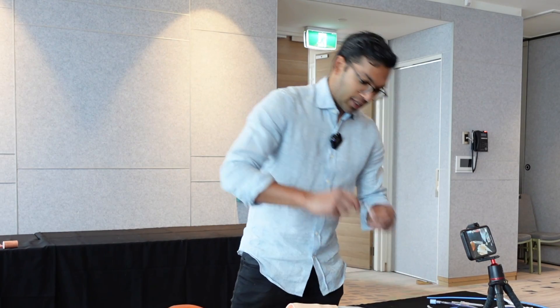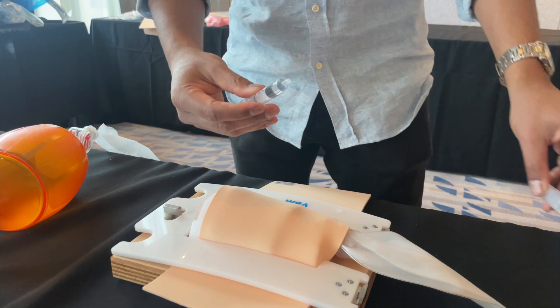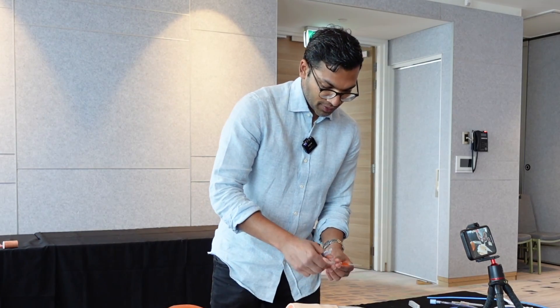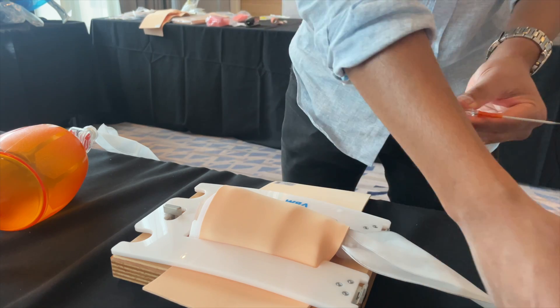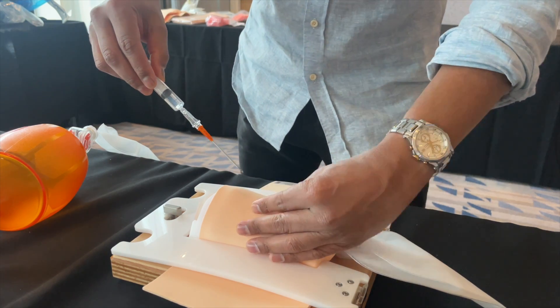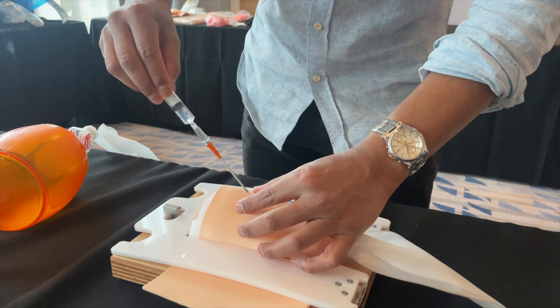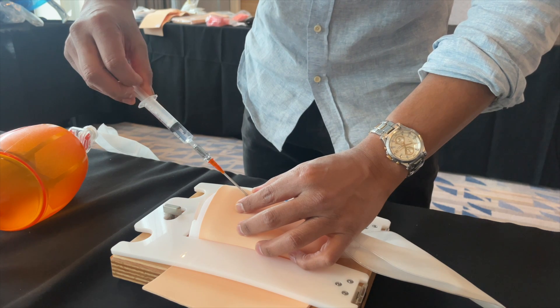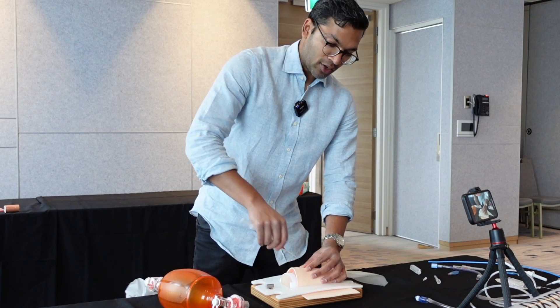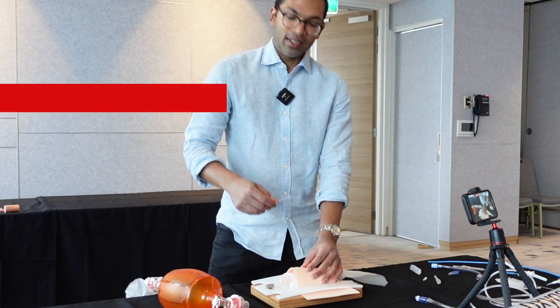I'll take my five mil syringe with two mils of saline, take my 14 gauge cannula, remove the back of that. After doing the laryngeal handshake, the initial attempt is not successful — I don't get the aspiration of air. So now I know that my trachea is going to be deeper.